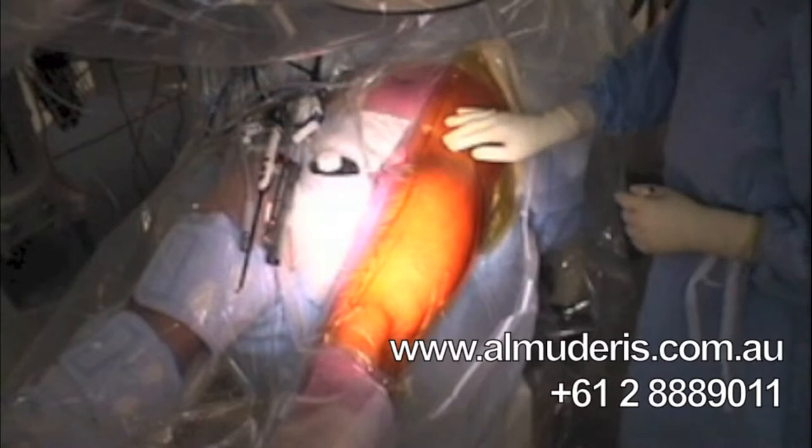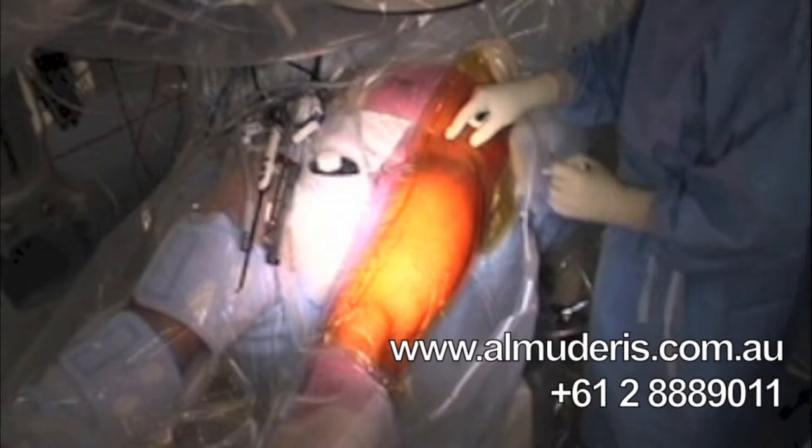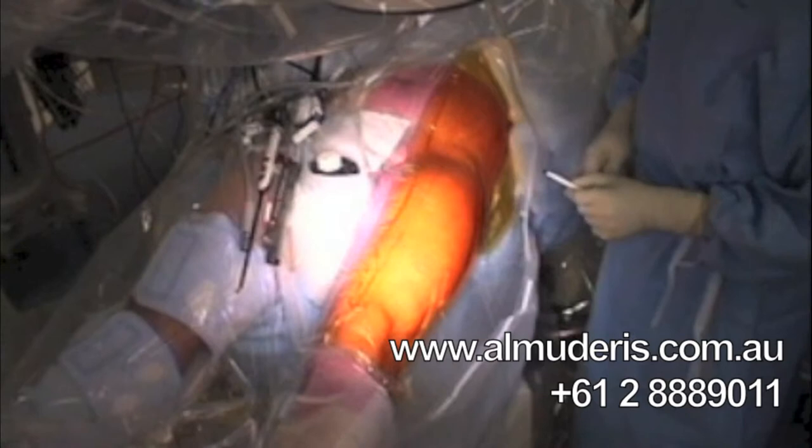So we are performing hip arthroscopy. I check the landmarks first before we start the case. The anterior superior iliac spine is just here. The greater trochanter is here. I make a vertical line toward the lateral border of the patella and a horizontal line from the pubic symphysis crossing down to the greater trochanter.